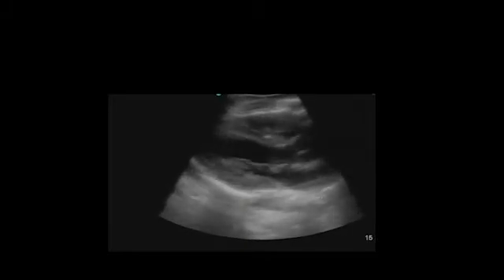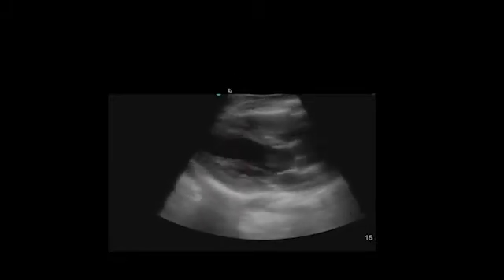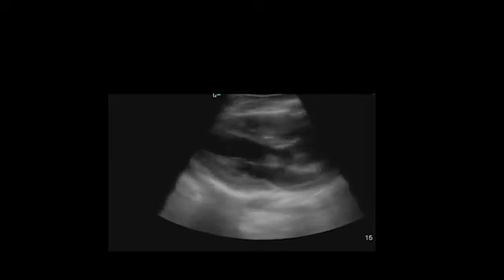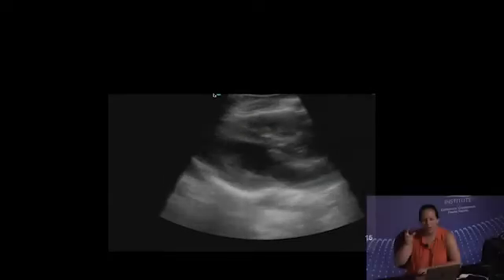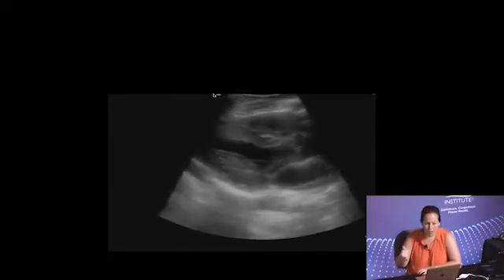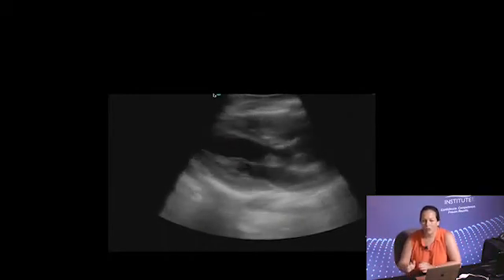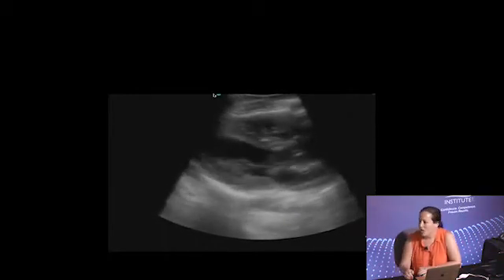That's actually a really good question. Yeah, on these, I'm using the abdominal setting. There are some, actually the institution where I am now, they like doing the cardiac setting. Just know, and the way you can tell, this one's in the abdominal setting, it's at 4 o'clock. Right, in the cardiac, it's flipped. Yeah, all of these are really confusing, and I've been doing it this way for my whole life, and then the past 2 years I've been in an institution that does it in the cardiac setting. So I have to, in my head, flip it around. What I would say, this is super confusing, and no one's willing to really come up with one way of doing it that would make it way easier for you guys to learn.